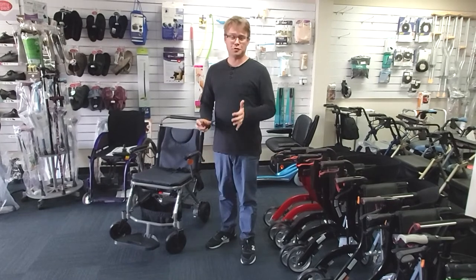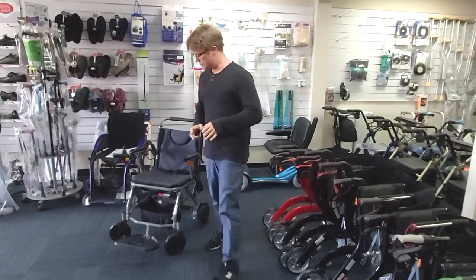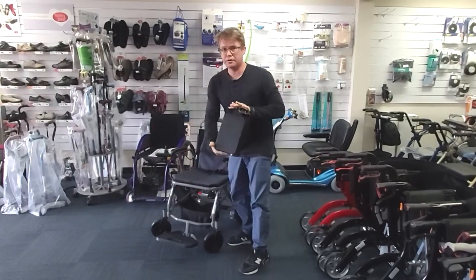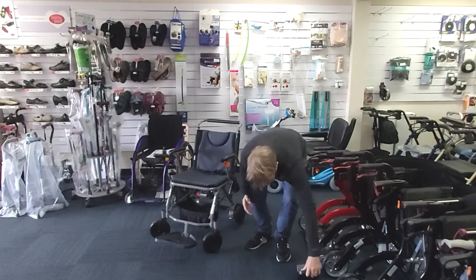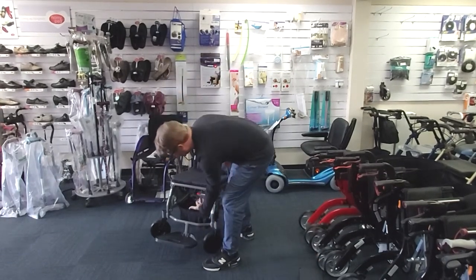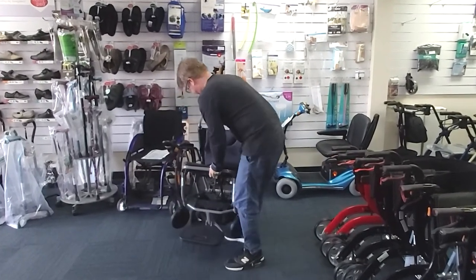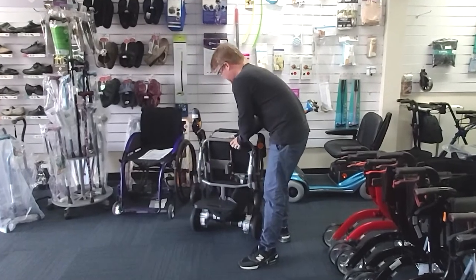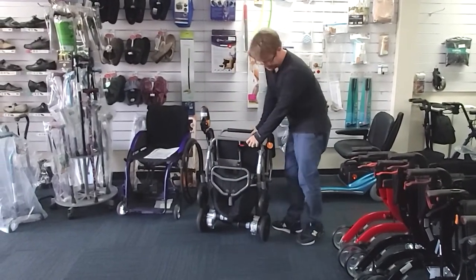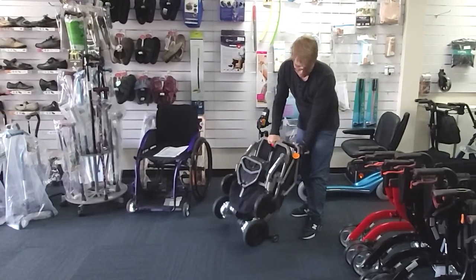What we're going to do is fold it up — it's pretty easy, really only two steps. Firstly, pull out the battery, and then there's a latch right here. Flip off the footplate as well. It does have wheels on the back — pull it around.